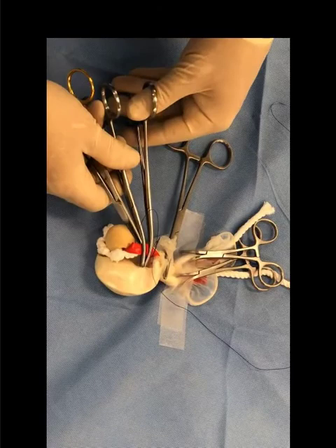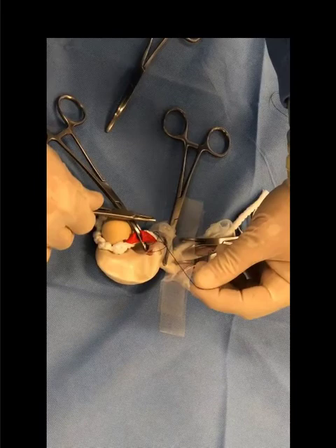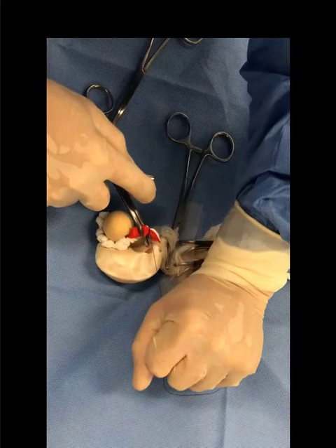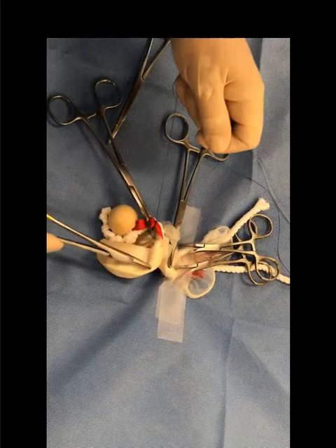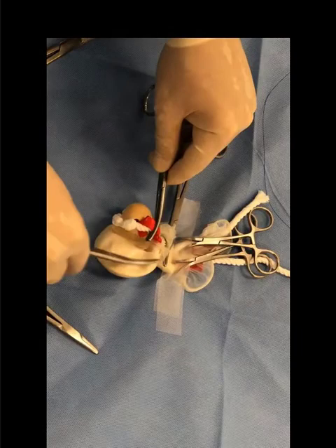I'm going to remove the most proximal Carmalt clamp and tighten up this knot. By keeping my instrument close to the pedicle I can pull on the other side and avoid wasting suture material. Equidistant from the ligature, I tie a nice tight knot, keeping tying until it's very very tight. Then I do a single throw back towards the midline and lock it off with a square knot — single throw to the outside, single throw back to the inside. Now we cut the excess suture ends with suture-cutting scissors. Depending on the size of the vessel that may be sufficient.